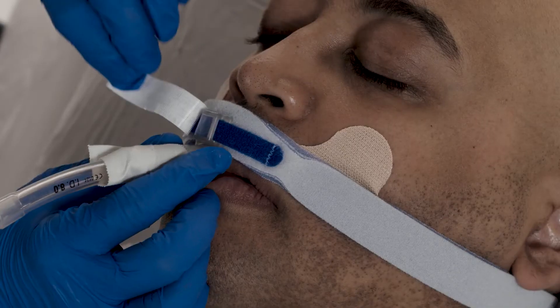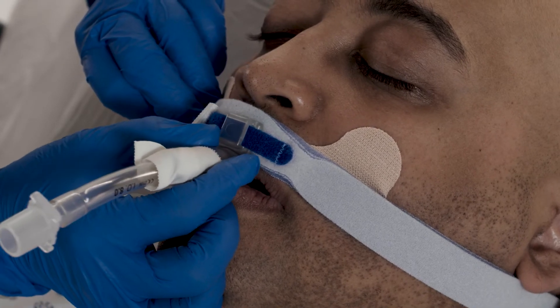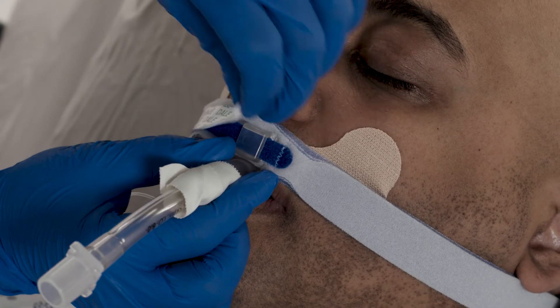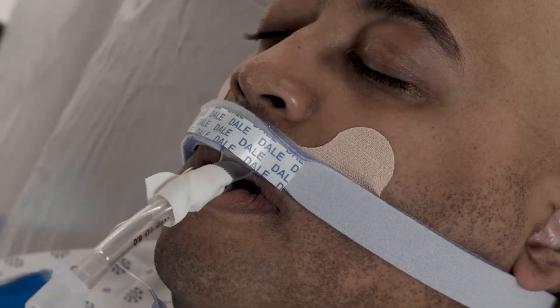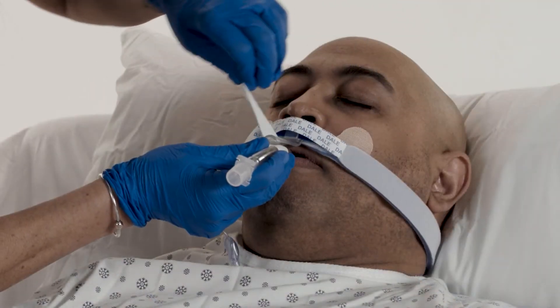Lift the Dale Overlay off the track. Slide the channel to move the ET tube to the desired location. Press the overlay back down onto the track and neckband to secure the tube position in place. Change tape as necessary.